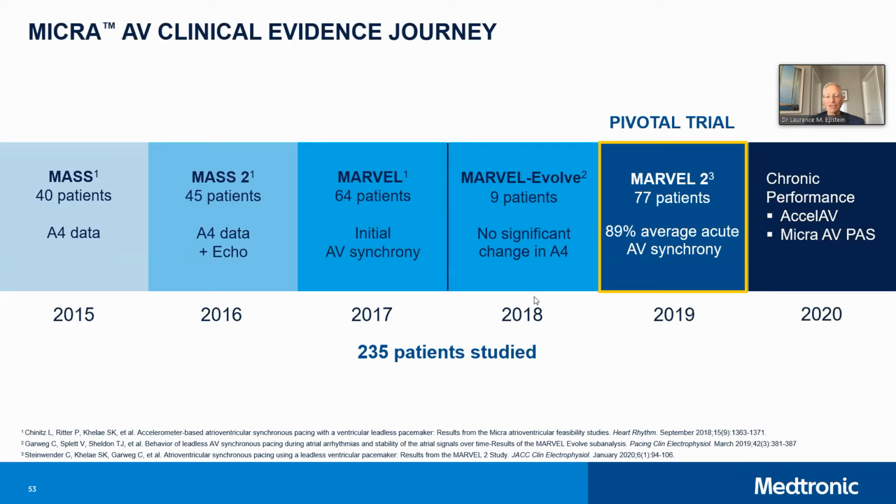And my experience is, I can sit through a lecture about all this stuff or read about it, but really, the way to learn about it is when you're at the program or kind of playing with this stuff. It's pretty intuitive and it makes sense. And the other thing I want to say, I know there's going to be a couple of talks in a Q&A period about patient selection. And I think the important thing to remember with this device, if you and your patients are going to be happy with using it, it's not a dual chamber pacemaker.